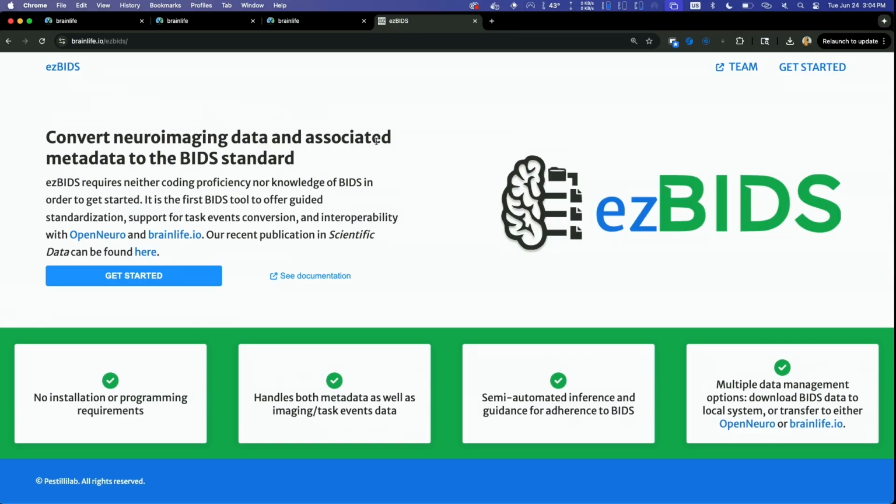Another question, sorry. Of course, please go. Converting the DICOM files to BIDS through NIfTI, is it automated? Yes. With this tool, it's automated. Being a clinician, can I just click, insert my patient's data or upload it, and then it takes everything automated afterwards? Yes, most of the things are automated. There might be some peculiarities with your data that you need to provide more information, but in general, it's just like clicking and typing. It's very informed, step by step.